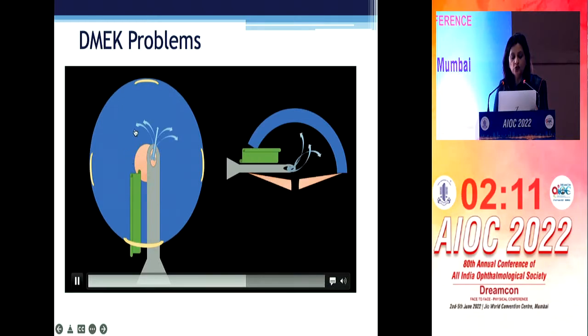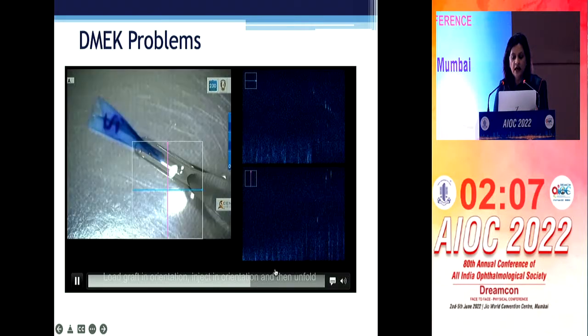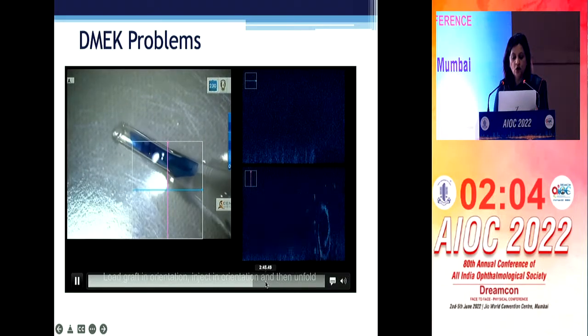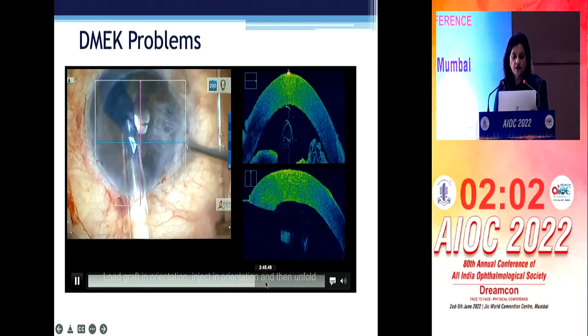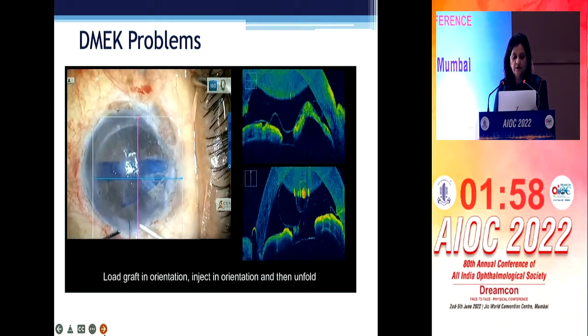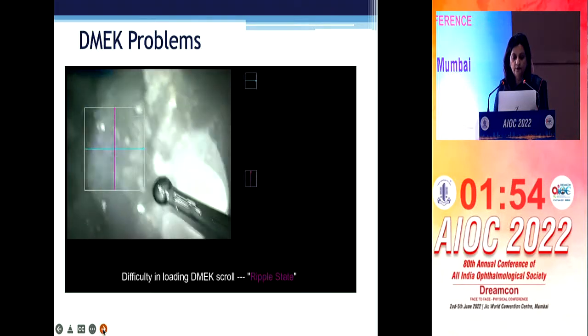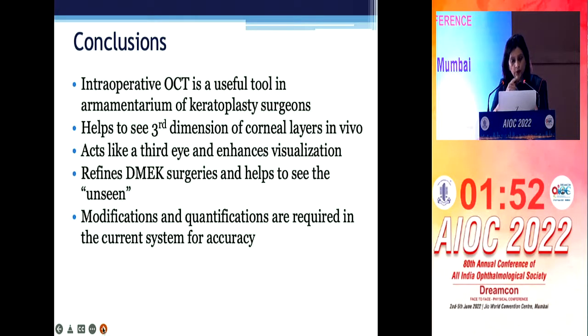So your fluid has to be above your docked area, with your injector, and the graft has to be loaded in the way that you load it, with the correct configuration only.